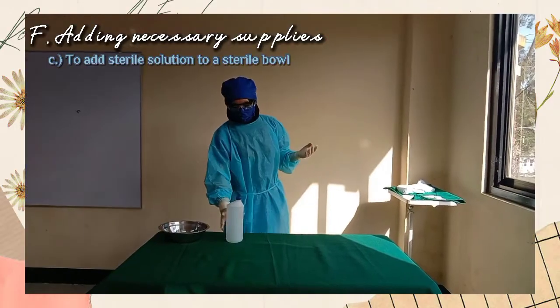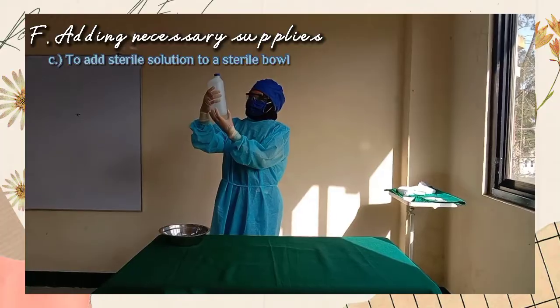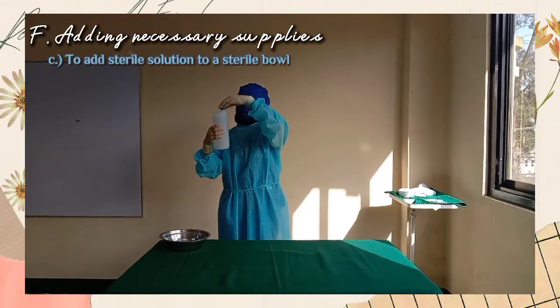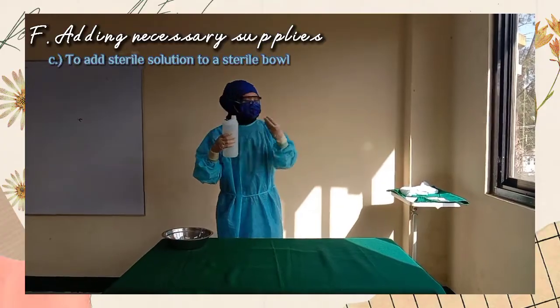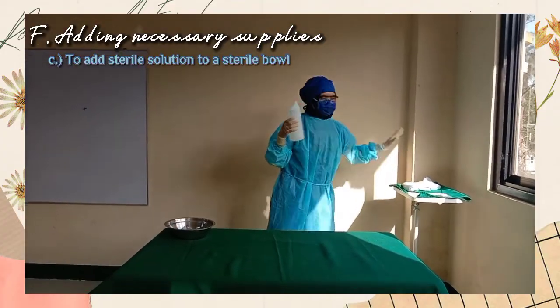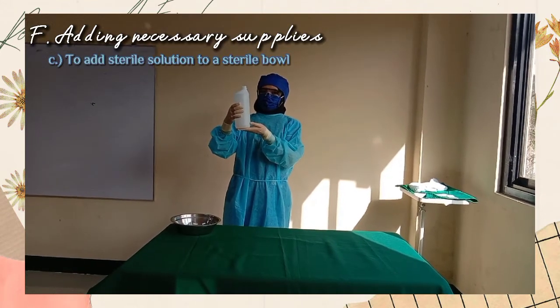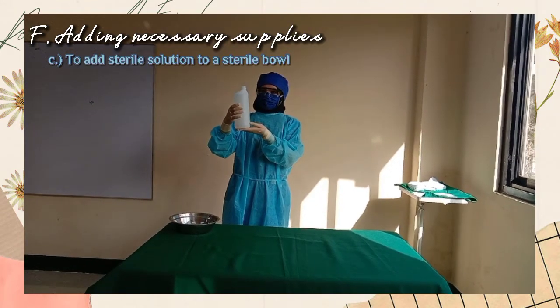Before pouring any liquid, read the label, the name of the solution, 3 times to make sure you have the correct solution, to avoid error by using the wrong solution. Open the solution container according to directions and place the cap on the table away from the field with edges up, to avoid introducing microorganisms inside the cap when it is turned down.